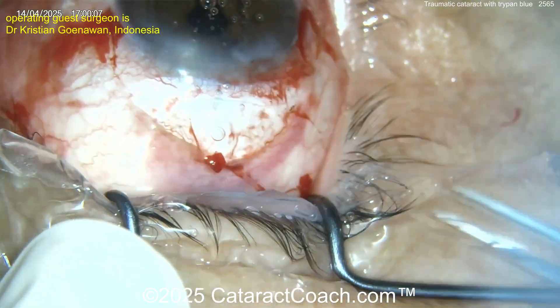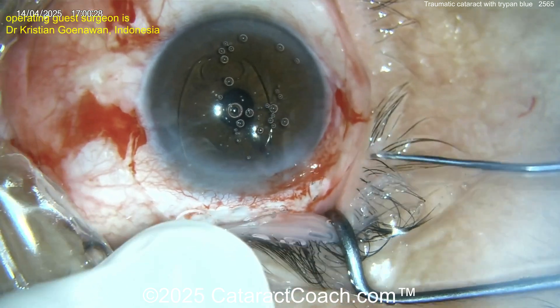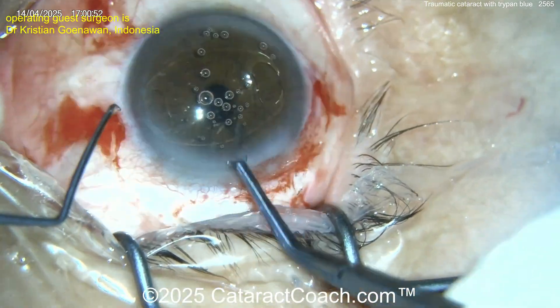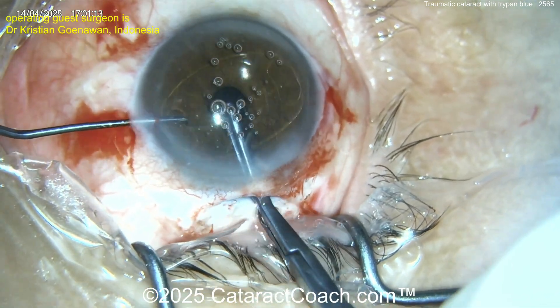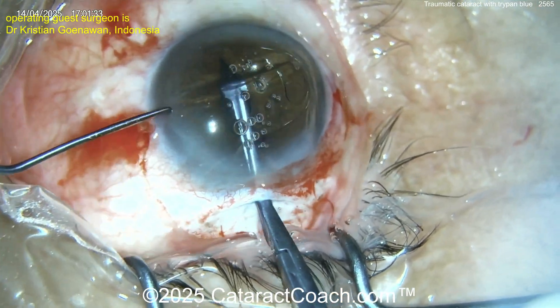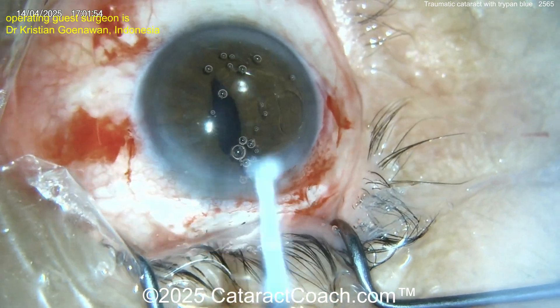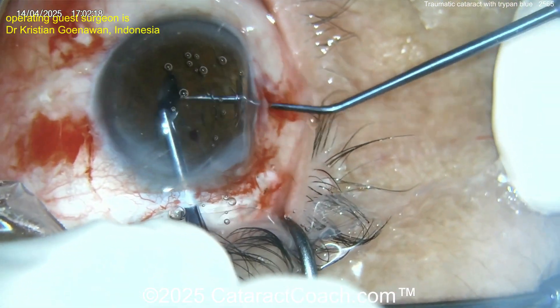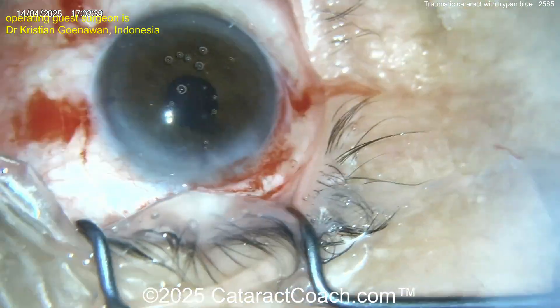These are the lenses I wish we had — unfortunately we do not have these in the USA. It's an iris clip lens and you can clip this to the back of the iris or the front of the iris, your choice, and it really holds on nicely with a beautiful result. Most of the time I've seen surgeons clip it to the back surface of the iris. Holding it here with the Bonn forceps — yes, back surface of the iris. The only version we have in the USA is for clipping to the anterior surface of the iris, for treatment of ultra-high myopia in phakic patients.